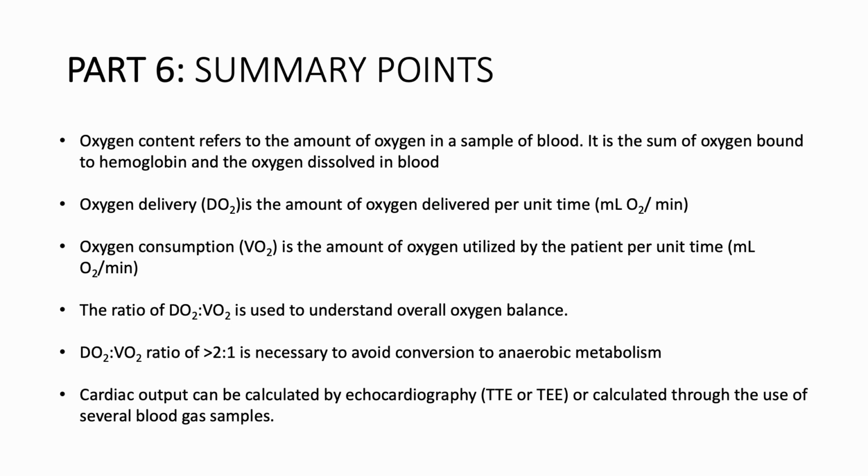And by going through that example, we've come to the end of part 6. Just to recap, in this section, we've introduced the concepts of oxygen content, oxygen delivery, oxygen consumption, and the oxygen delivery to consumption ratios. We also worked through several example cases and learned how to calculate these values, as well as learned how to calculate total cardiac output for patients on VV-ECMO, which will help us in times when the traditional methods of measuring cardiac output may not be available or possible.